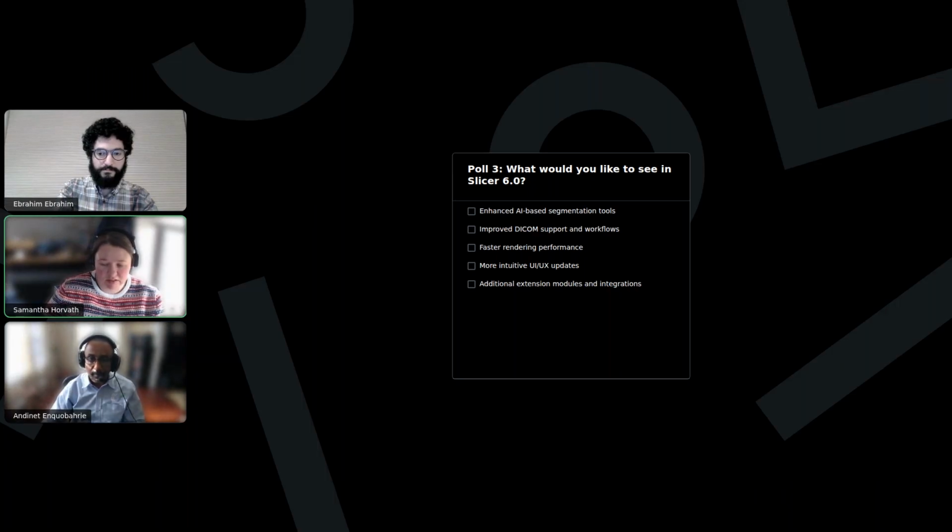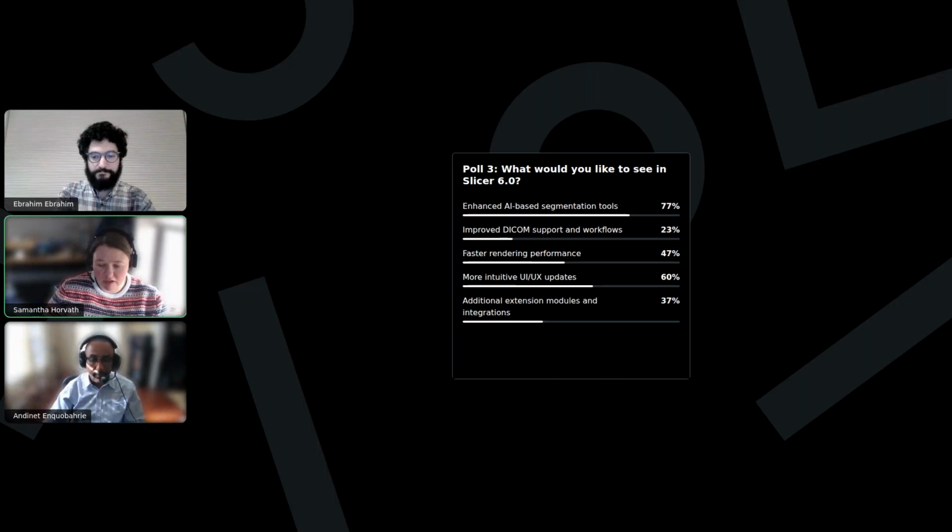And we do take this feedback very seriously. Slicer has always been a community-driven project, and your input helps shape our roadmap. The development team actively looks at what users are asking for in webinars like this, on our GitHub repos, and on our discourse forum, so we can best figure out what the community needs, because that's the best way to focus our energies as we are allocating development resources. If you have more detailed suggestions or feature requests, I encourage you to post them on the Slicer discourse.